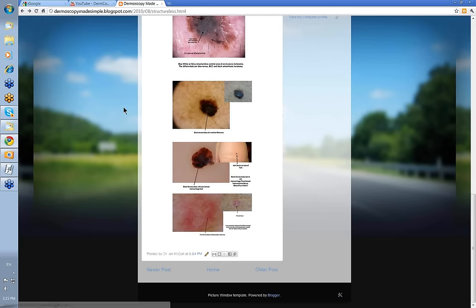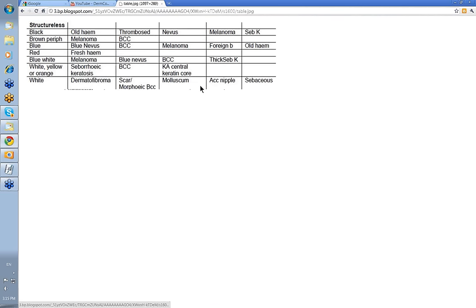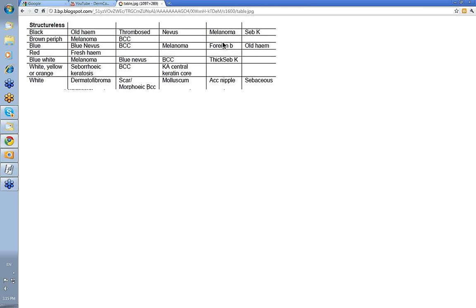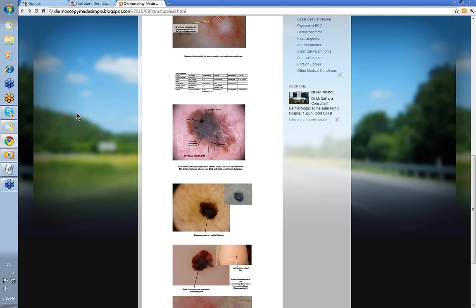So Structureless — there's a variety of different colors to look at. White Structureless for dermatofibroma is probably the easiest. The blue-white areas in thicker melanomas are something to be aware of. Black Structureless — remember old hemorrhage when it's on the sole of the foot. And the blue Structureless of blue nevus, BCC, melanoma, foreign body, and old hemorrhage. We'll see more examples of these in the clinical sections of Dermoscopy Made Simple later on. That's a quick overview of Structureless. Thank you very much.